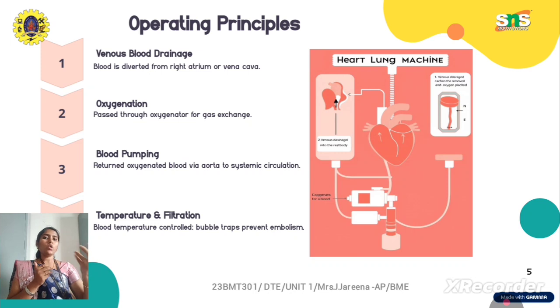And also we have the filtration, that is the bubble filtration, because bubbles carry a very potential risk. It may end up with a clot, or even cardiac arrest, or it may stop the flow of blood. So in order to avoid this, we have a trapping mechanism where, if there are any bubbles, they get removed, and it prevents all sorts of embolism.